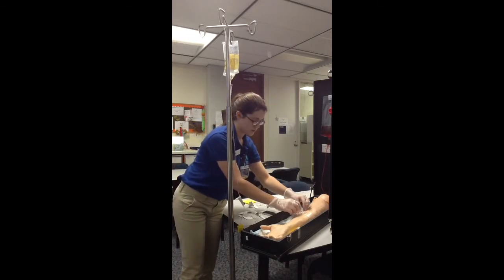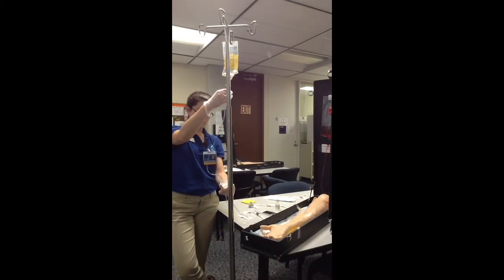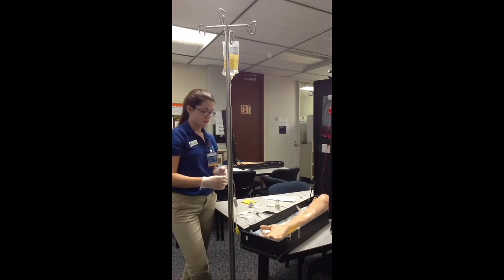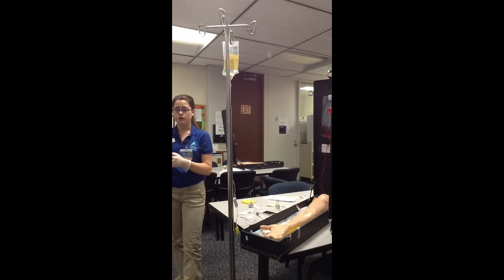Okay, and my tubing is unclamped. And now squeeze my filter chamber, and I'm going to establish a drop rate, which we figured was 42 drops per minute. And I would wait and count that out. So I have 42 drops per minute. Okay, and then I would continuously check Mrs. Jones for any phlebitis or infiltration or any concerns that she had. Okay, so now I would leave the room, wash my hands, and Miss Jones, how do you feel?